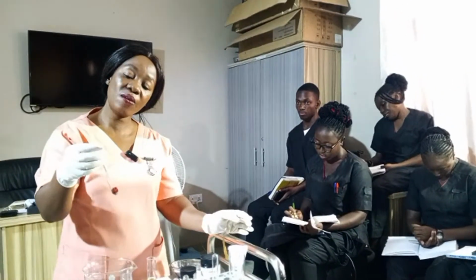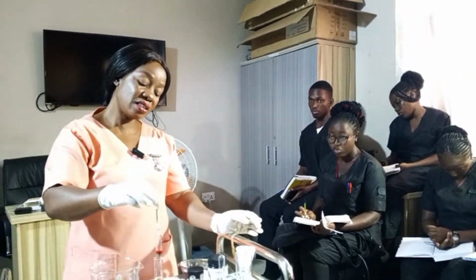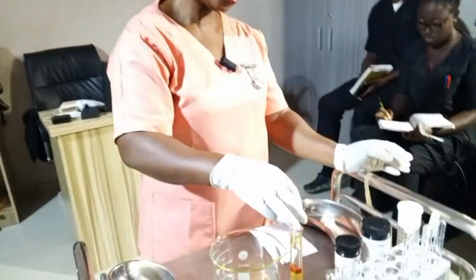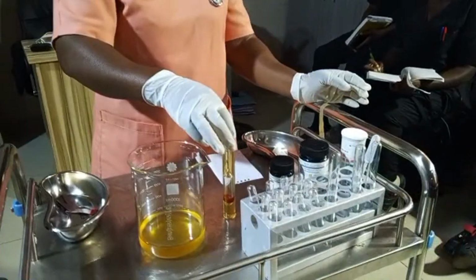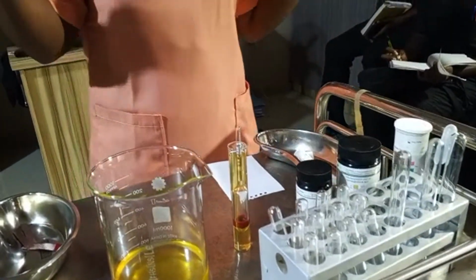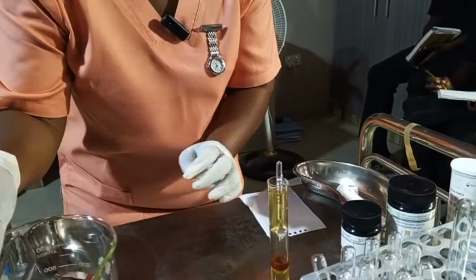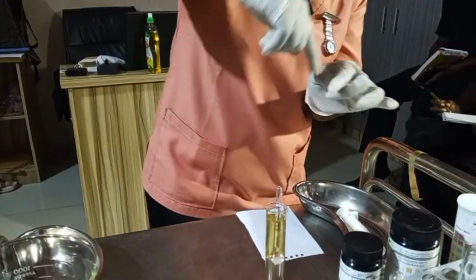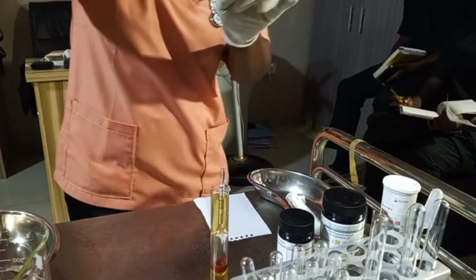So now you dip this into the test tube. Do not allow the urinometer to touch the edges surrounding the test tube.